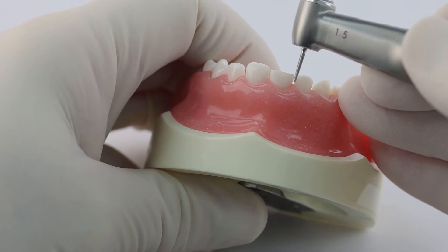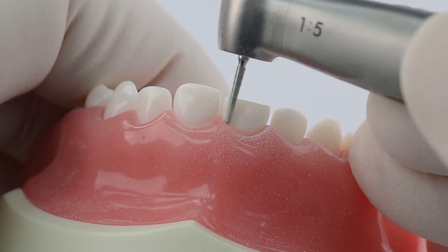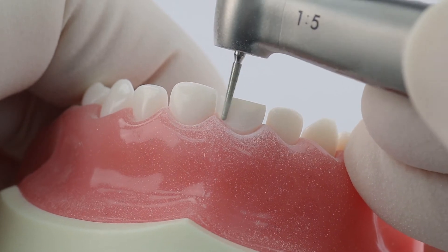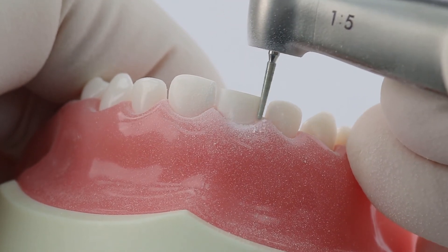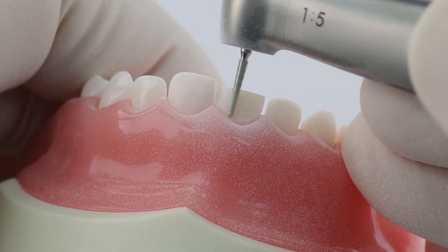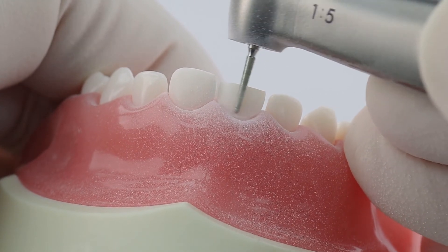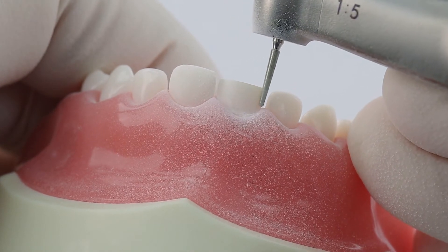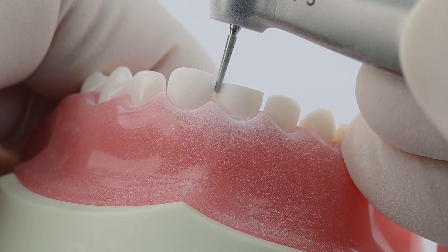We are going to basically make a little line right at the tissue level. I like to do big sweeping movements and do the whole buccal surface — just stay in that little line all along the gum line. We're not going below the tissue yet; we're just going to the tissue, the depth of that burr. And we're maintaining the burr parallel to the long axis of the tooth.